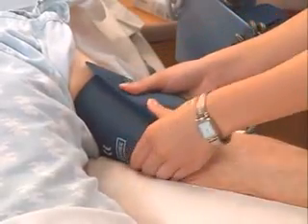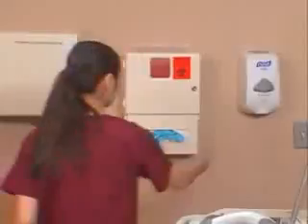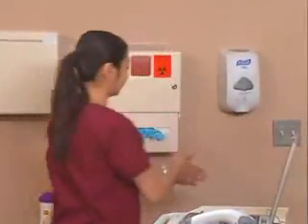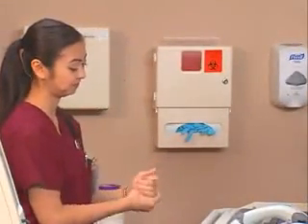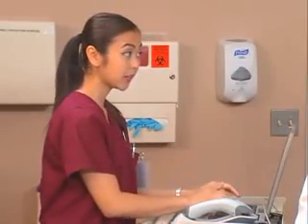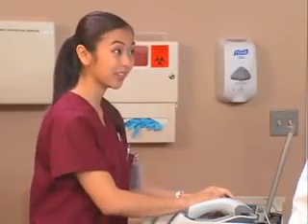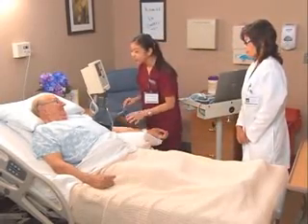Yes. It has completely deflated, correct? Yep, it's completely flat in his arm. Let's document. You identified the arm used? I did, and if we used a site other than the brachial artery, I would have noted that too. Okay, that's it for this measurement. I'll be back to record the remaining measurements and check up on you.